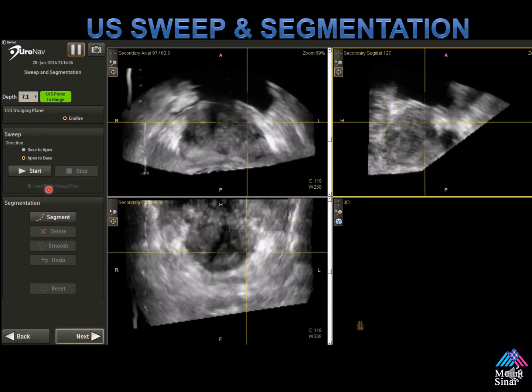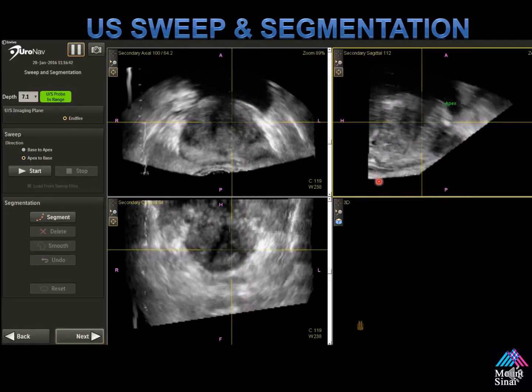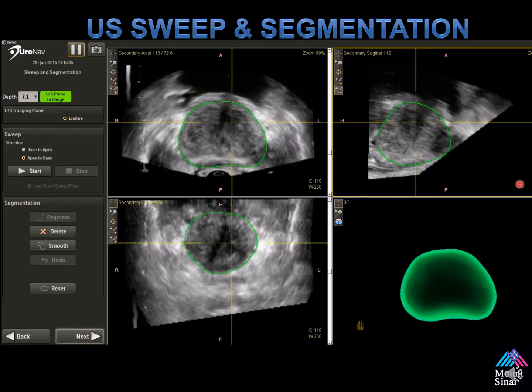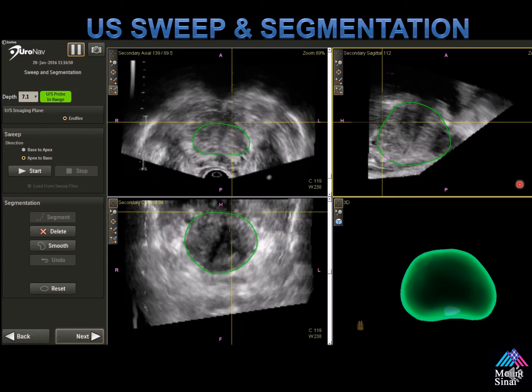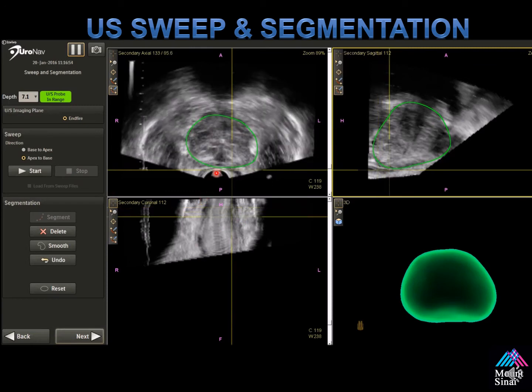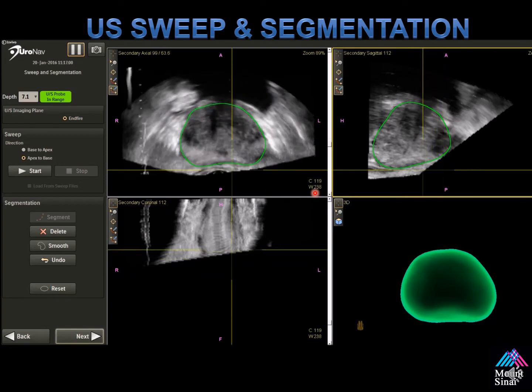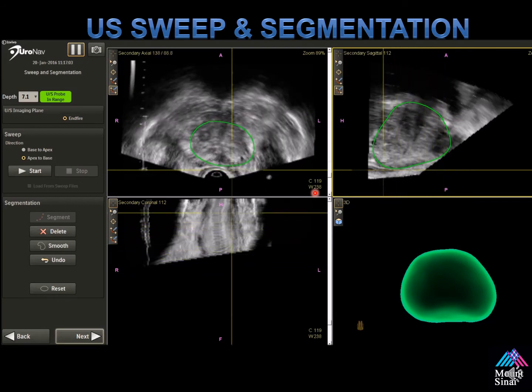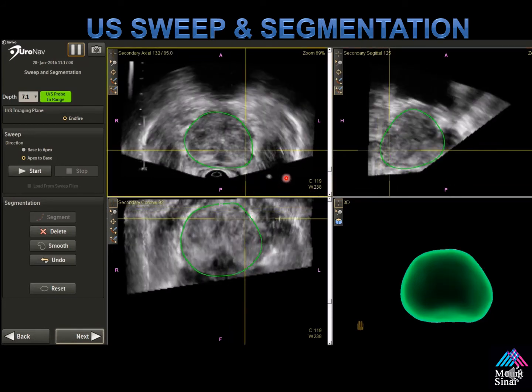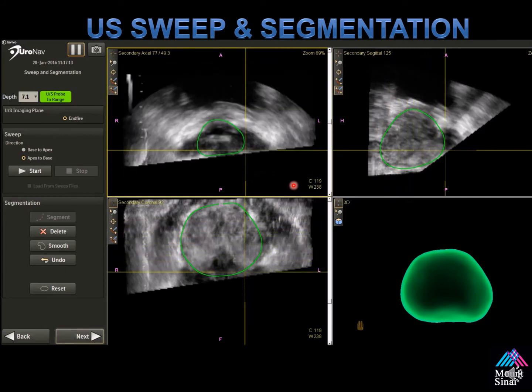The automatic segmentation captured almost the entire prostate. See how I fix it — the red areas are where I'm warping the image to make it fit. The green outline matches the red outline that you saw on the MRI segmentation. The purple line highlights what you're stretching the model to make it line up. This is relatively easy when the automatic segmentation works well.